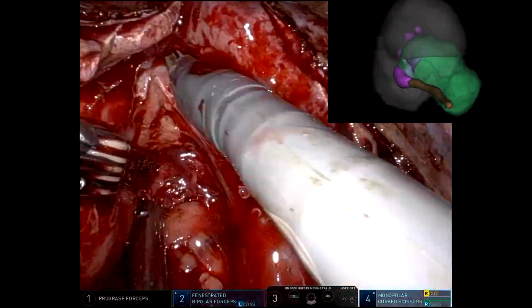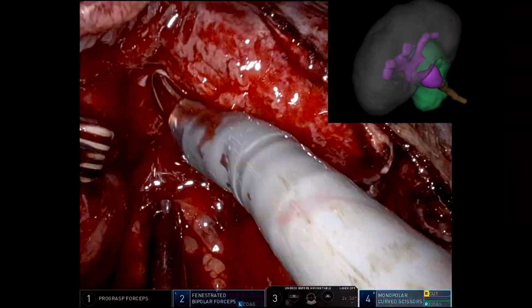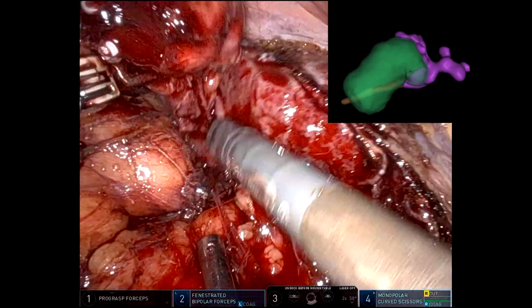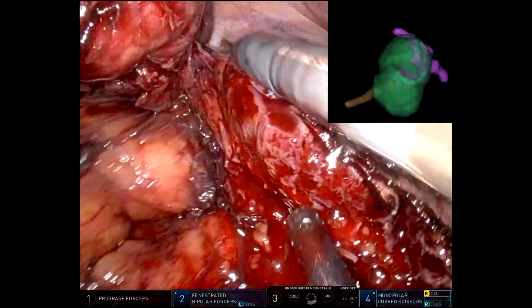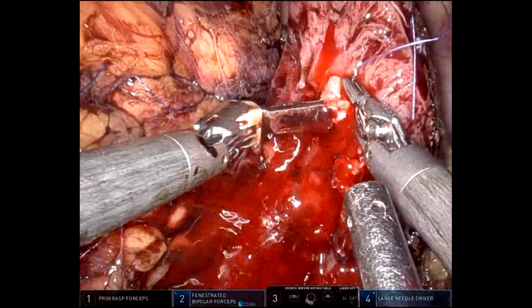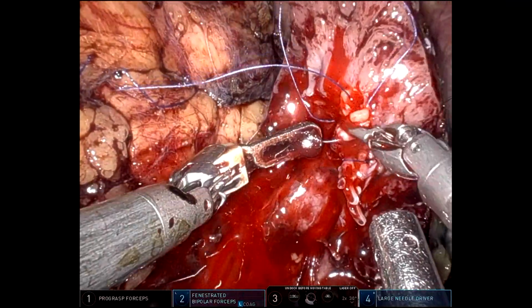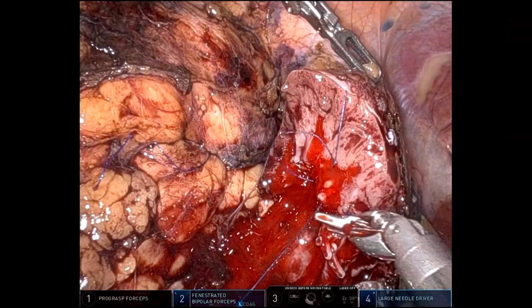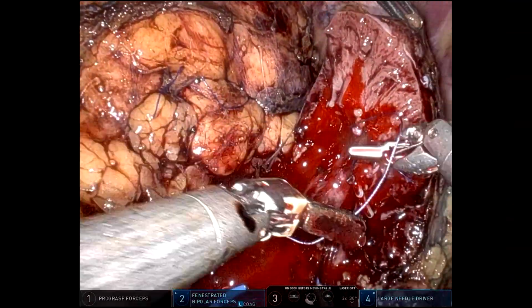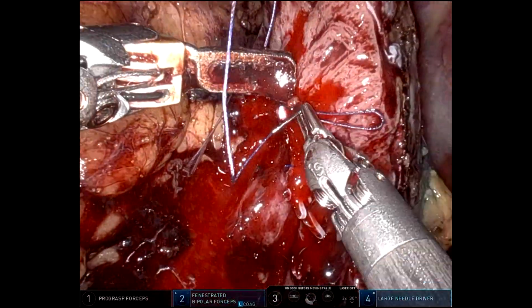The 3D reconstructed virtual model had predicted that the tumor was in close proximity to the pelvicalyceal system, with a separation of less than 1 mm. This critical anatomical detail enabled heightened intraoperative awareness, helping to anticipate and manage potential collecting system entry. The pelvicalyceal system was inadvertently opened as anticipated, and a 6 French ureteric catheter was placed beforehand for normal saline instillation. It can be closed separately using a 4-0 Vicryl suture. Alternatively, in other cases, it can be closed concurrently during the inner renorrhaphy, in a continuous manner using the PDS suture.